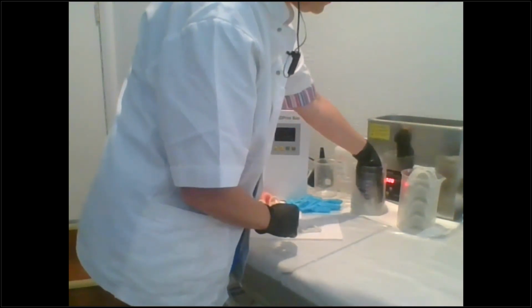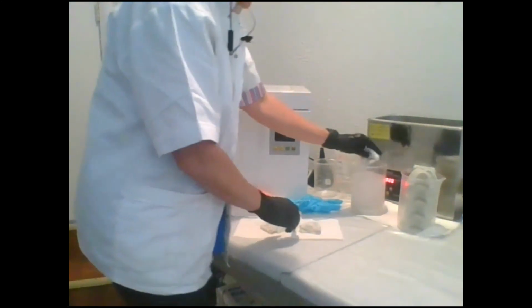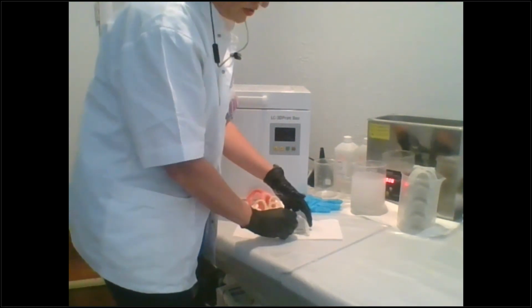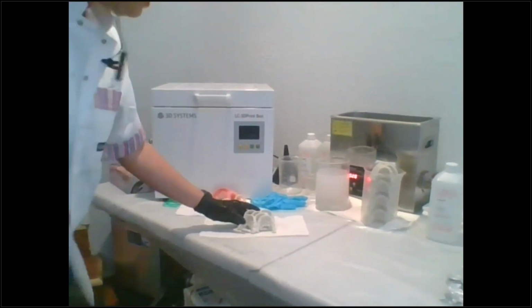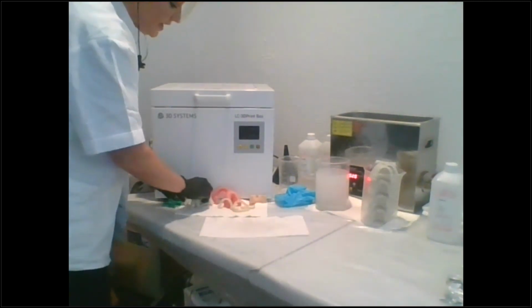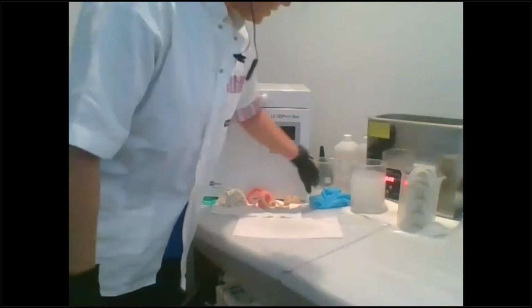Use your air hose. I don't have compressed air here with me because this is my home office. So I have to let mine sit for half an hour. But if you had air, you could just dry them with your air hose, okay? And when I dry my parts, I like to set them up. Can you see that? I like to set them up against the oven. So you can see I have all different kinds of parts that I'm printing today. But everything is drying and it's all setting up upright, okay? So after you've air hosed it and dried it, turn on your oven.